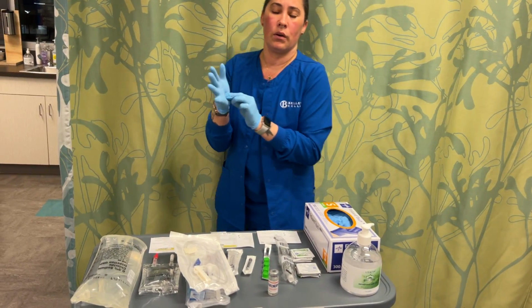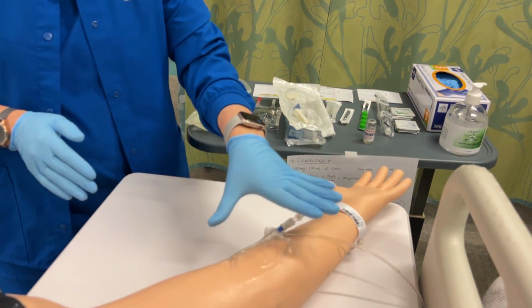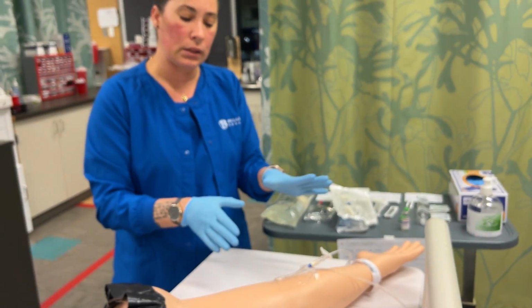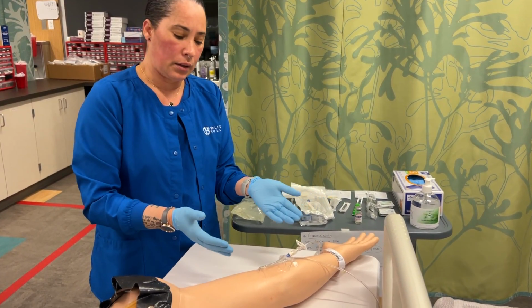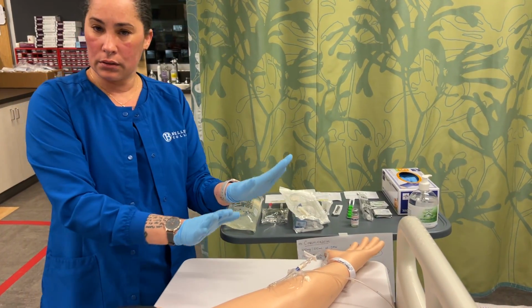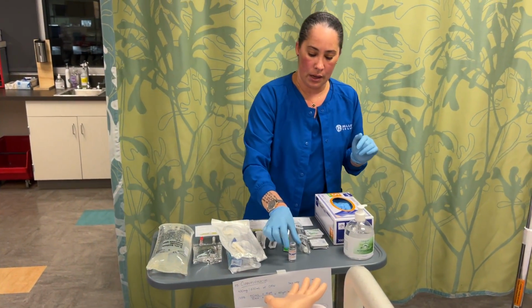And then next I'm going to go ahead and just assess the patient's IV site. You just want to make sure everything's clean and intact, that the skin looks nice and healthy, that there's no redness or swelling, and any puffiness, like tightness of the skin. It could just mean that there is infiltration or something's wrong with the catheter for the IV. So far everything looks great, so we are going to move forward and we're going to do our ondansetron.